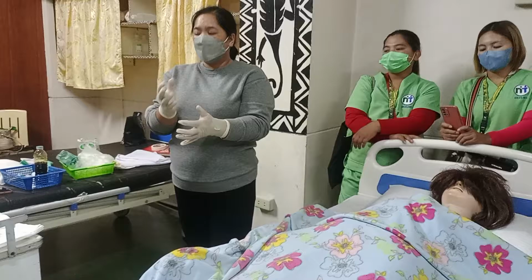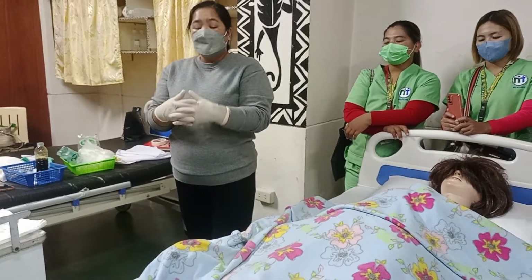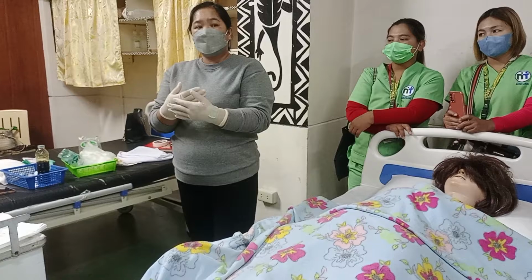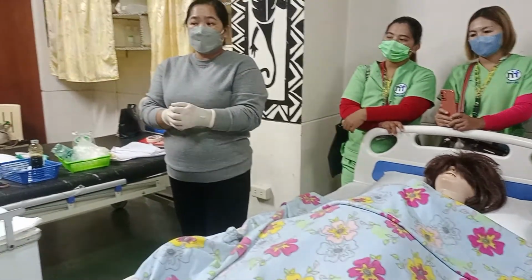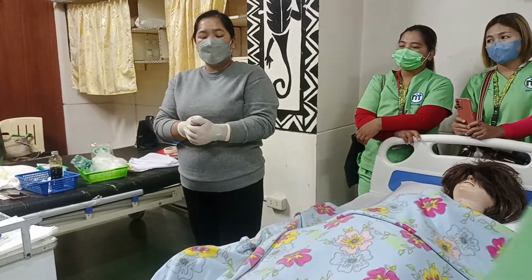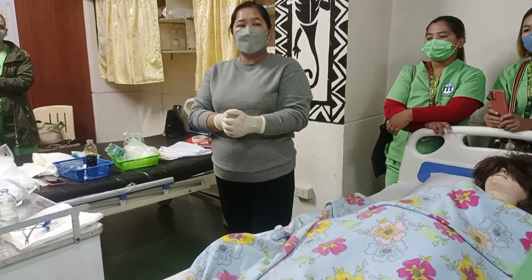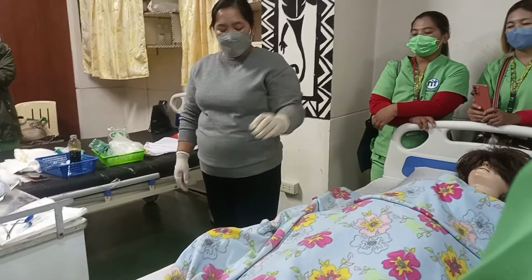Tayo, kapag napupuno yung urinary bladder, dun tayo nakakaramdam na naiihi tayo. Sila na naka-catheter, hindi napupuno yung urinary bladder nila. Therefore, nawawala yung sensation na naiihi sila. Now, you have to train the bladder to feel that before you remove this. Kasi kung tinanggal nyo to na hindi pa na-train yung bladder, tumutulo yung ihi ng patient niyo. Lalabas ang ihi. Okay, so wag ganun. So, anong gagawin natin?